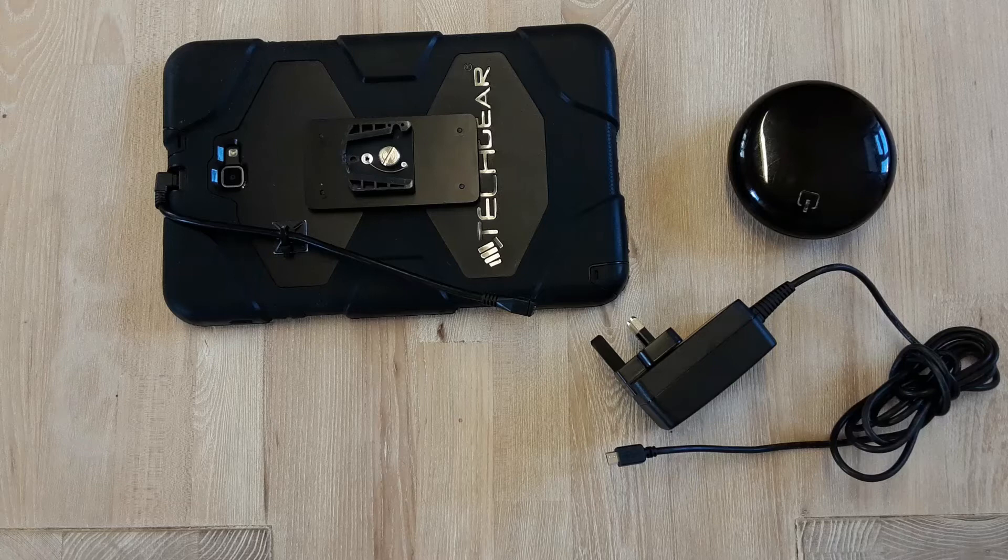Hello, in this video we're going to explain how to connect the charger to the Quayot Hub and the Samsung Quayot Tablet.